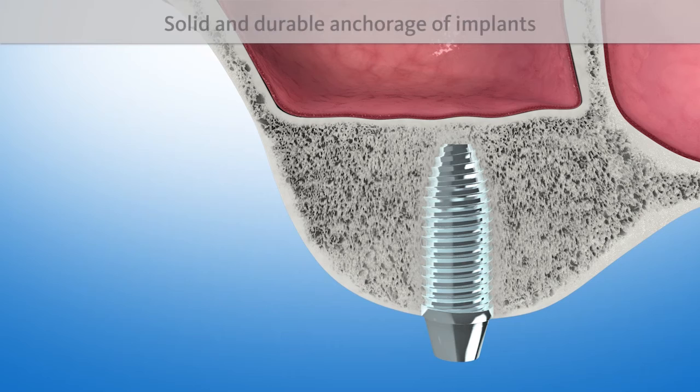The implant is now anchored in the body's own bone, just like a natural dental root. This ensures a solid fixation over time.